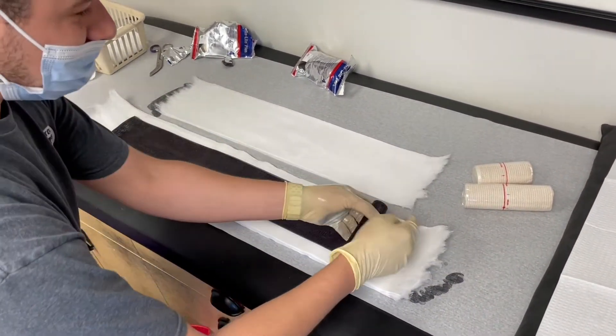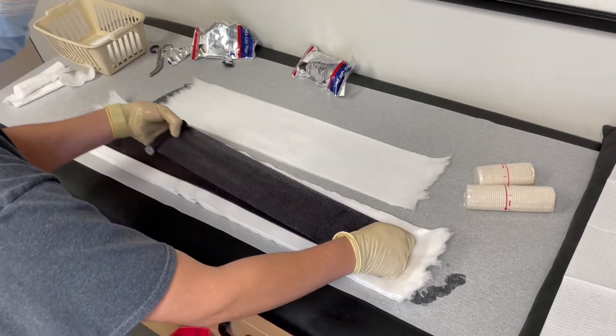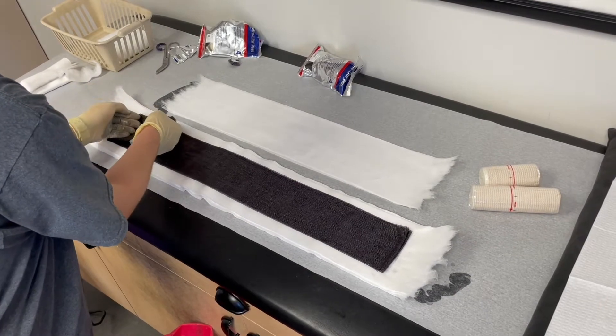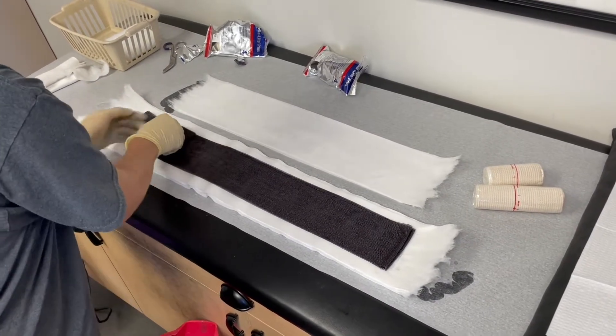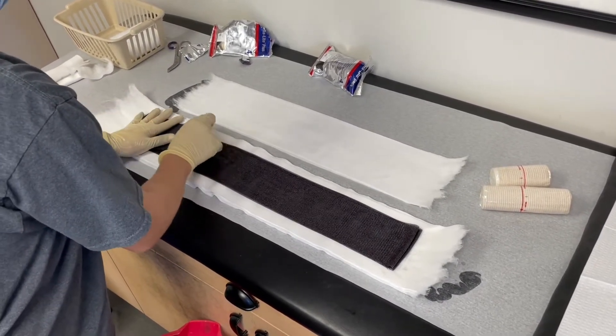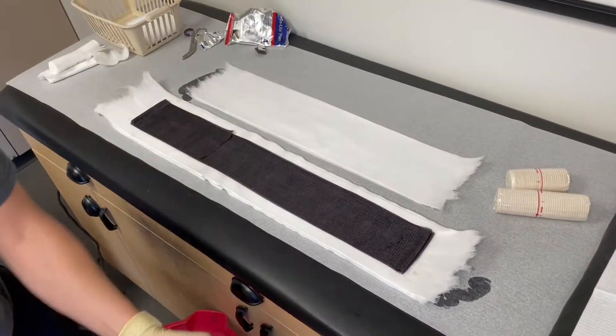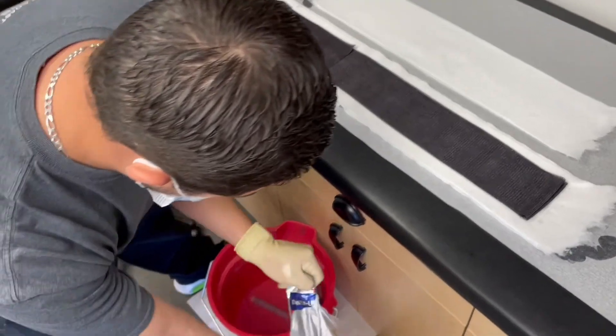We'll go ahead and put nine layers of the fiberglass down. We'll go ahead and get another roll of fiberglass tape to continue the splint.